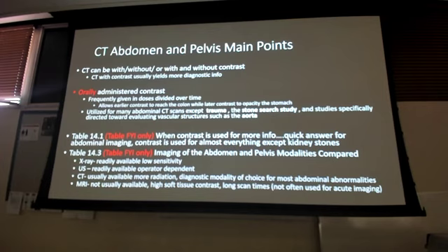What does the large bowel typically do with fluid? Reabsorbs it. So I'm not going to have them drink this liquid and have it go through the small bowel and then wait for it to go all the way through the large bowel. That's going to take too much time and the odds are it's going to start reabsorbing some of that. It might not be a good picture. So we just do the barium enema, do the rectal contrast, fill their large intestine up with barium, take my quick x-rays, my quick picture, take it out, it drains, hydrate them, and they'll be good to go. But we'll look at what some of those pictures are.